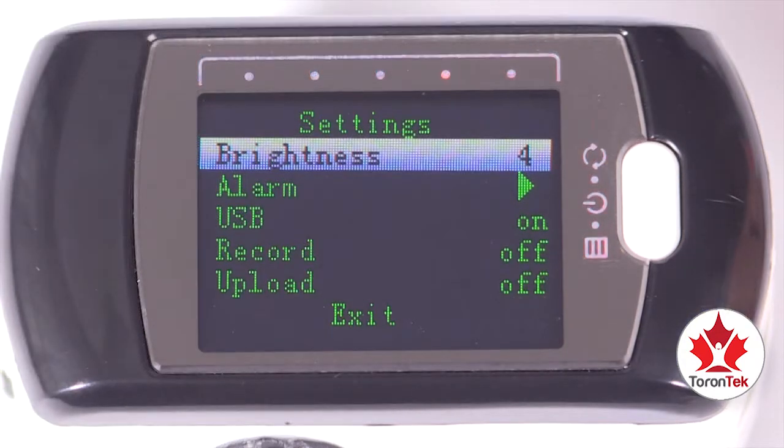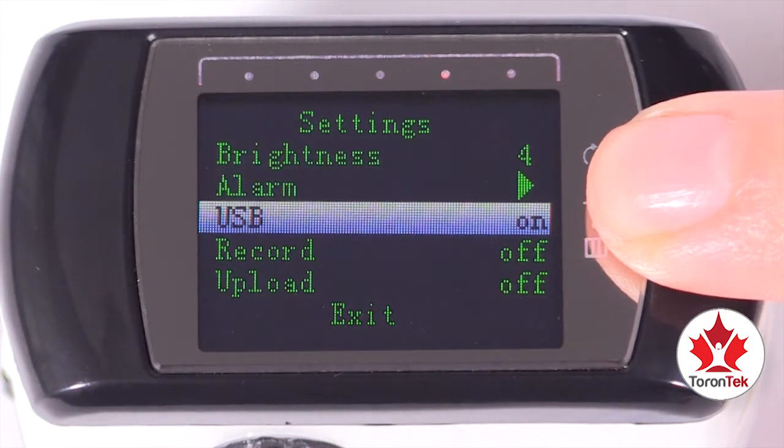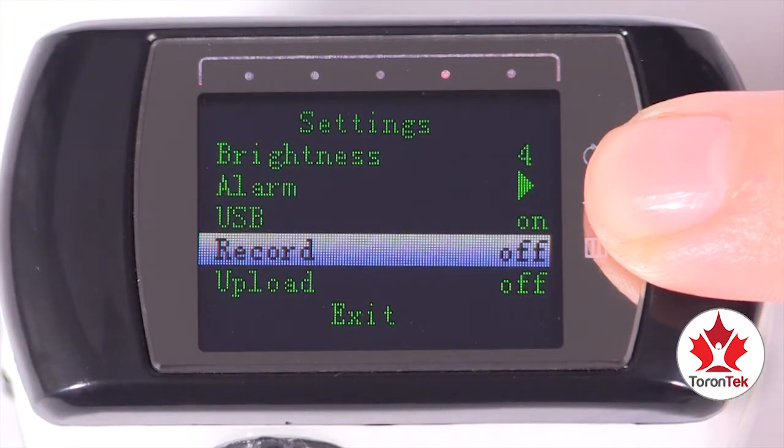To move from setting to setting, press the menu button once. When you reach the bottom of the list, the setting options will start again from the top.